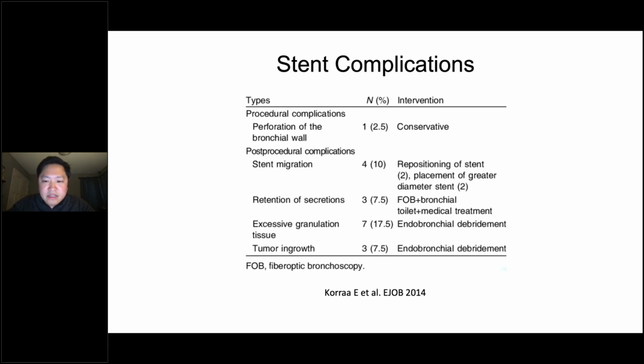And the way we get around it is that we do have surveillance bronchoscopies for that patient. So we never forget about the patient. We can always see when it gets loose, and then we remove it. So we've really toned down on these unexpected ER visits where the stents are now in the trachea, things like that.